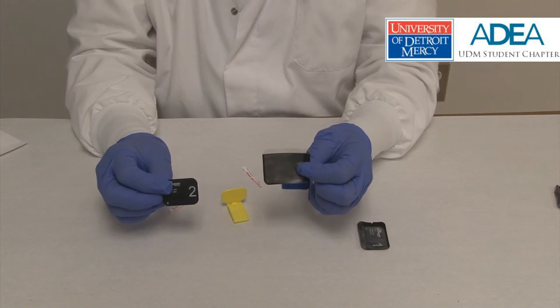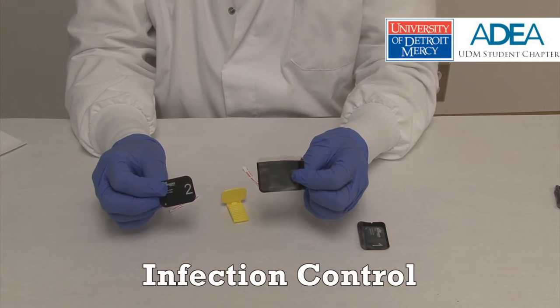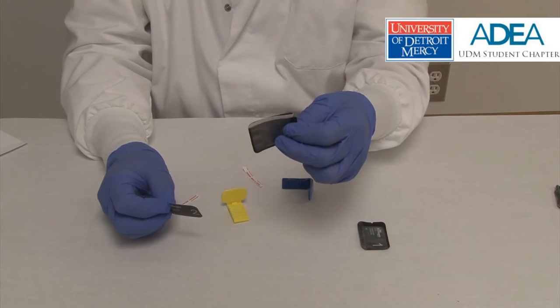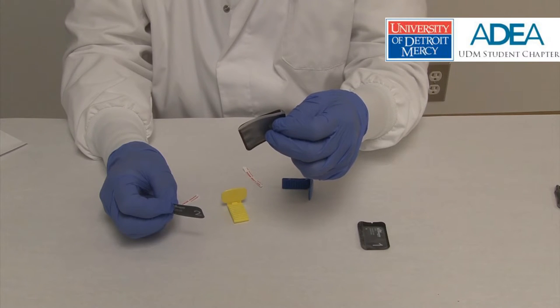What is the purpose of the protector sleeve? The general answer is infection control. The scanner plates cannot be sterilized or disinfected by usual means. The sleeve protects them from contamination during placement in a patient's mouth and keeps them germ-free for subsequent downstream processing and reuse. What sources of contamination might a dentist or hygienist encounter during X-ray placement?